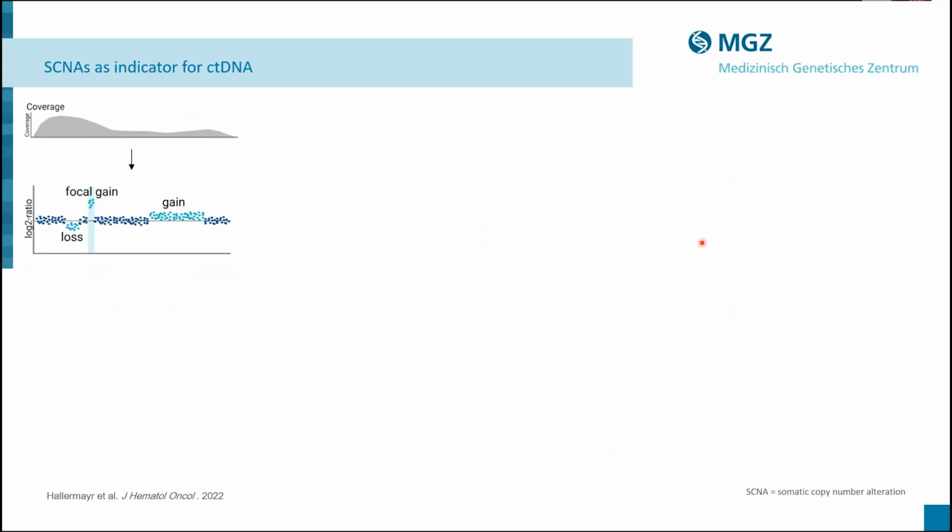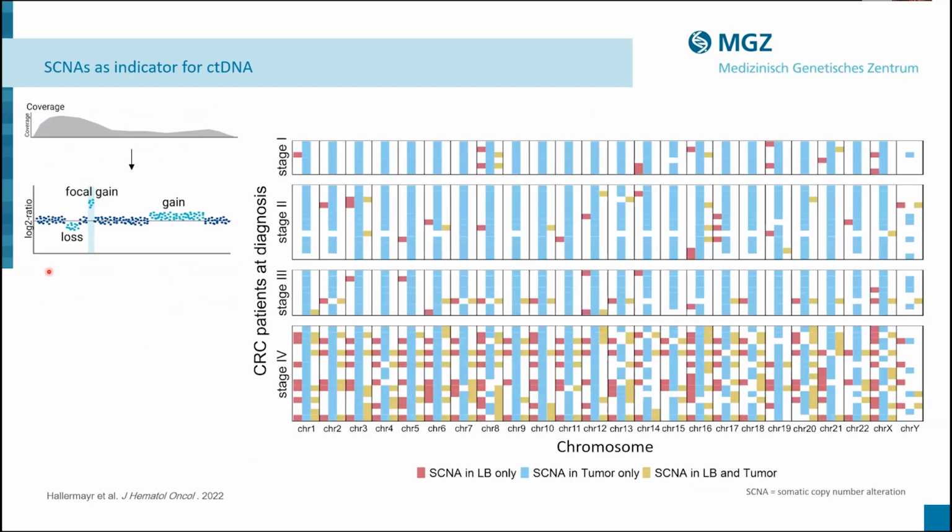And then we also didn't only want to focus on those non-genetic alterations, but also genetic alterations, because as Ellen mentioned in her talk already this morning, somatic copy number alterations have a clinical implication, for example, also for the treatment for patients. And this analysis, of course, is also based on sequencing coverage.